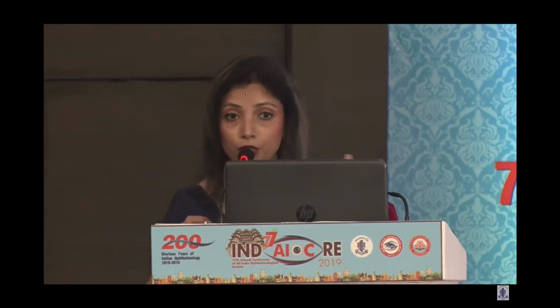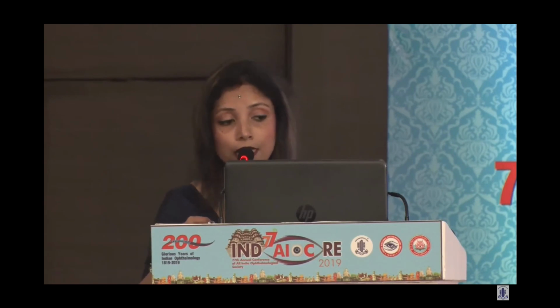The sterilization part, which is the most important: the reprocessing of surgical instruments is of utmost importance because often the source of infection is from our instruments. So there are certain rules that need to be followed when we are doing the cleaning of the instruments. The cleaning should be done immediately after use.